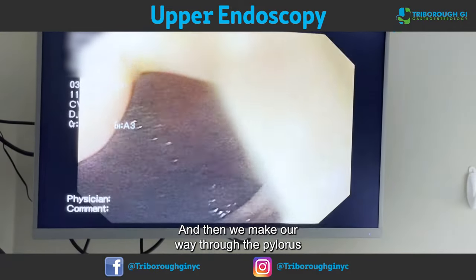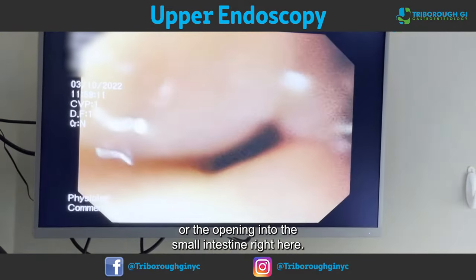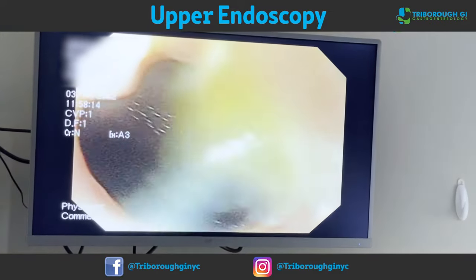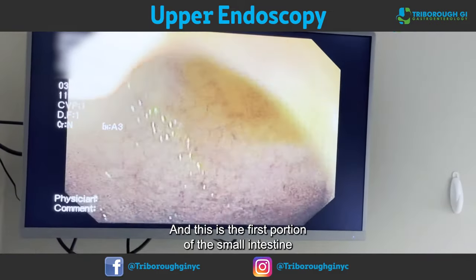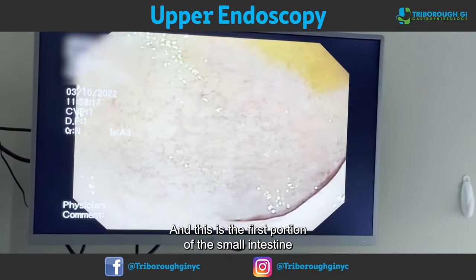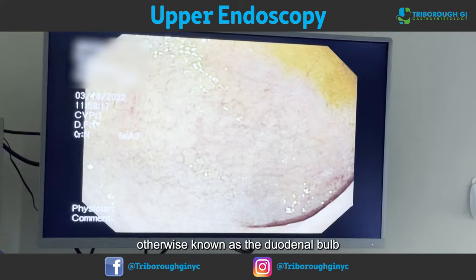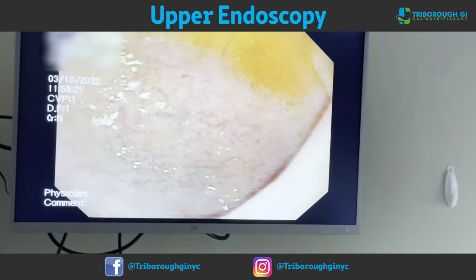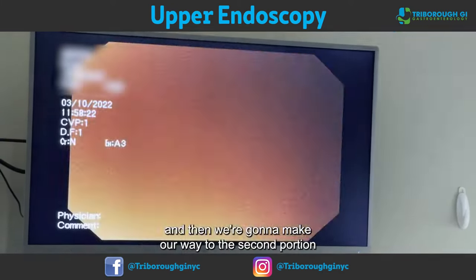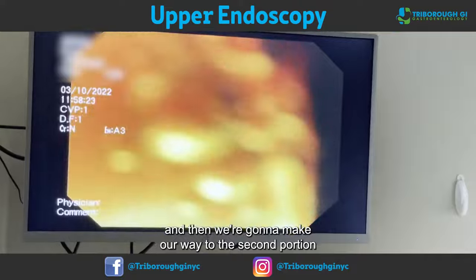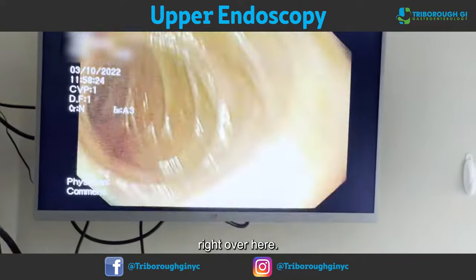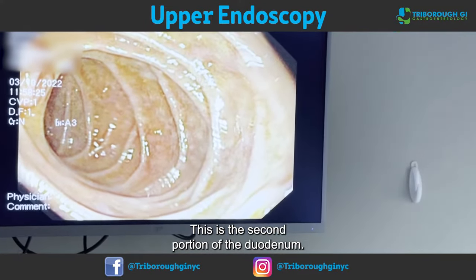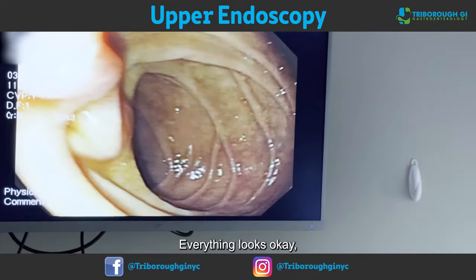Then we make our way through the pylorus, or the opening into the small intestine. This is the first portion of the small intestine, otherwise known as the duodenal bulb — this looks perfectly normal. And then we make our way to the second portion of the duodenum. Everything looks okay.